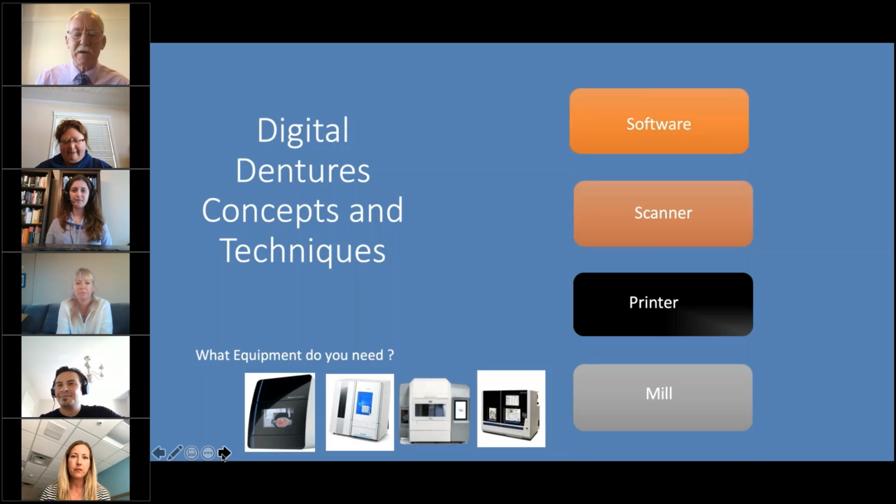The IMES now has come out with what we didn't talk about, an ionizer. If you're going to look at a mill, the first thing is it really needs to have an ionizer, in my opinion, if you're going to mill prosthetics. As soon as you mill acrylic, it generates electrostatically charged particles, and you want an ionizer that takes the charge away from the particles and makes it easy to clean.